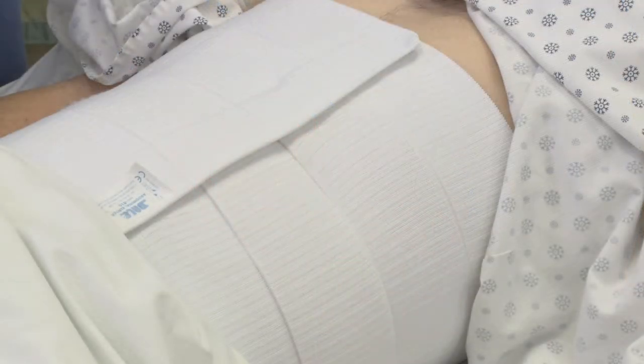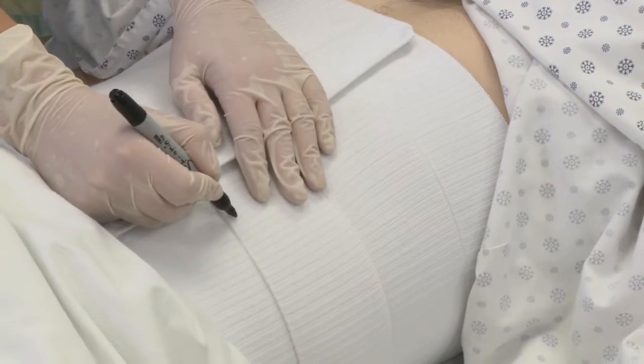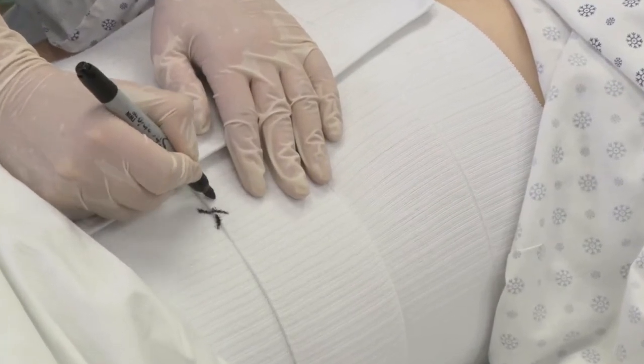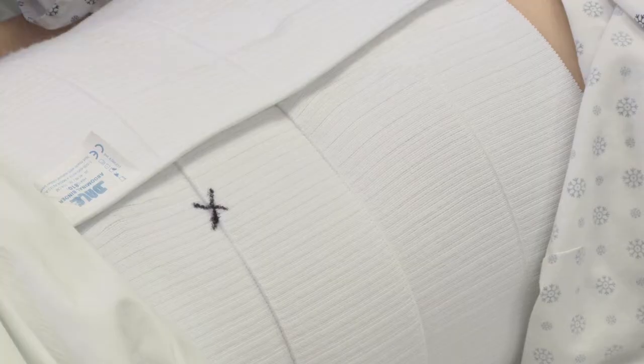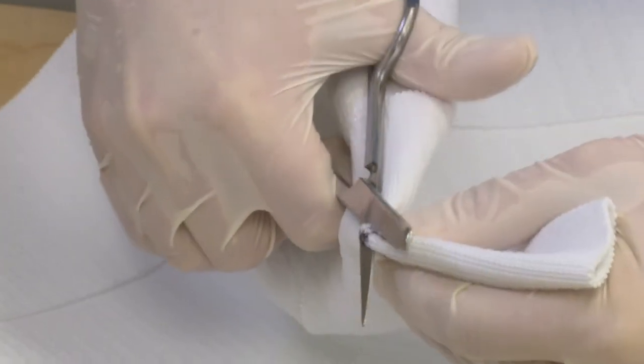Begin by resting the binder over the drainage site. Be sure that the material is laying flat and that it's not doubled over. Mark the fabric vertically where the hole will be made. Crease the fabric and make a very narrow elliptical cut in the material.